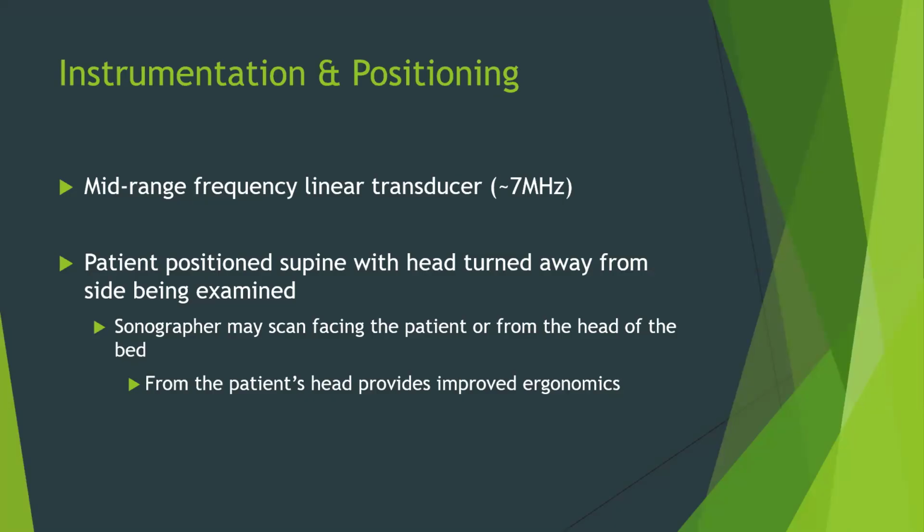So you can be facing the patient or facing away from the patient. What I mean by that, right, is that their head is to your right here, and their feet are below you. So that would be facing the patient, or you can do it where their head is facing you, right? And you can kind of scan one way here and then the other way here. This can help with ergonomics. I worked in Boise. We called this the Boise backhand.